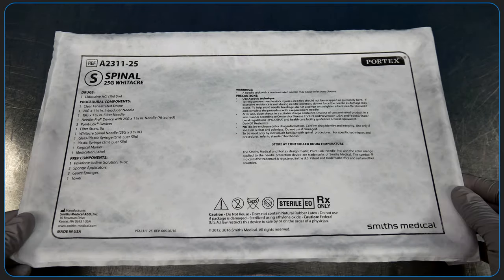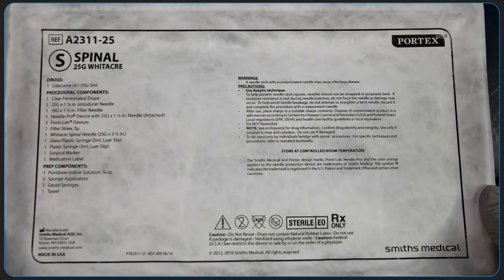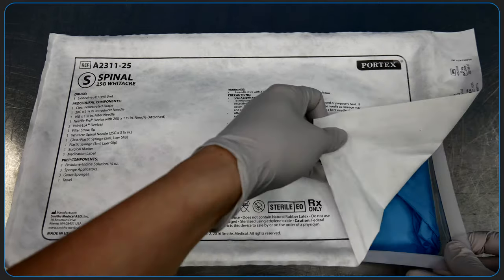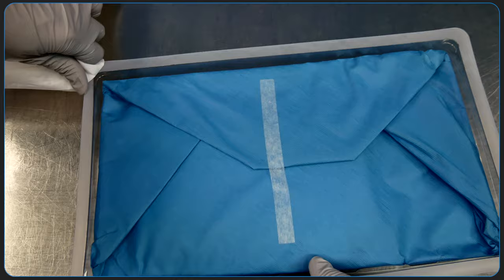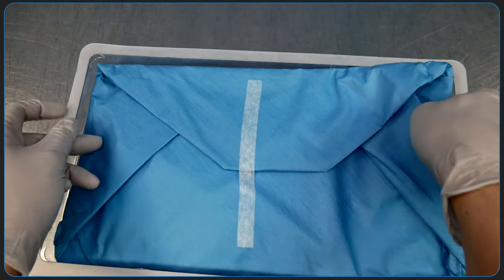In this video, we're going to demonstrate how to set up for administration of a spinal anesthetic. At our institution, all of the supplies are included in a spinal kit, with the exception of the spinal anesthetic itself, any adjuvants like opioids, and chloroprep sticks. We'll go through what's included in the kit and how to set it up effectively.